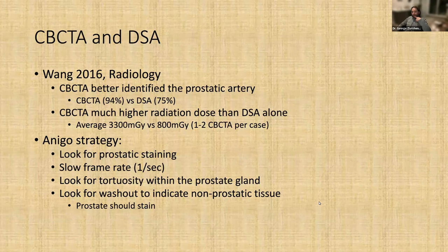I've done a couple of cases where, you know, the more and more you do, the more adept you become at knowing what the anatomy looks like, the staining, and when there's non-target embolization. But I still, you know, 90% of the time will perform a cone beam CT.